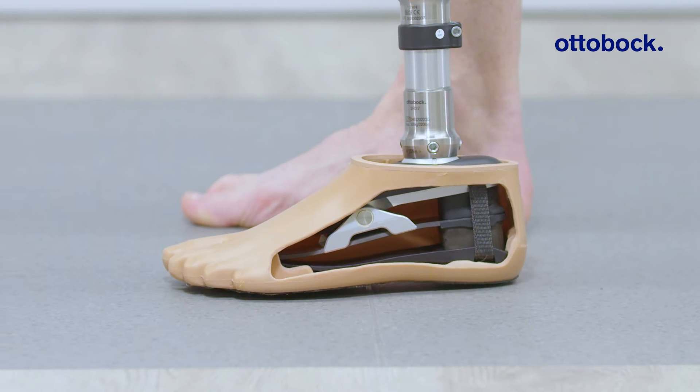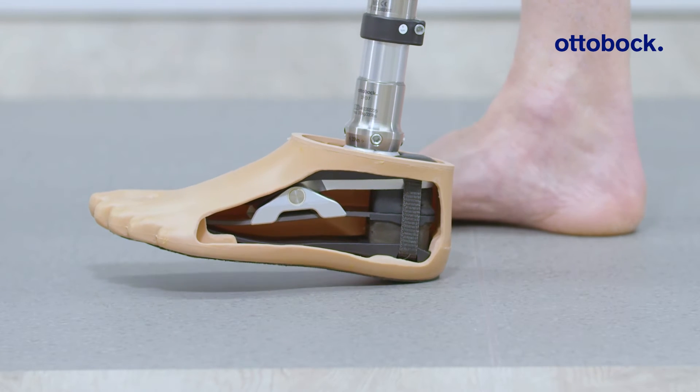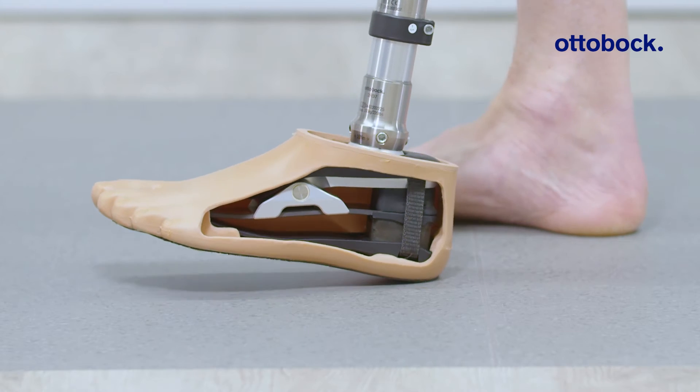This new design allows multi-axial compliance — four degrees of torsion in both directions — and an impressive one centimeter of vertical shock absorption. Now let's take a look at what makes Evanto's rollover so lively and natural.